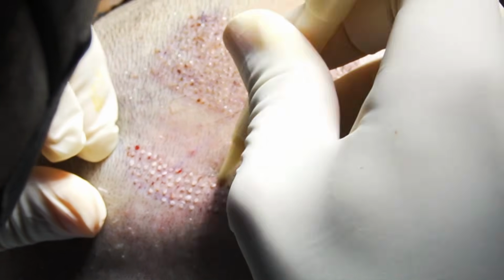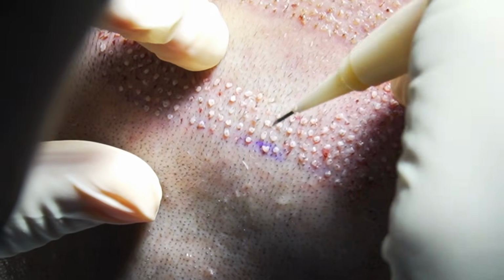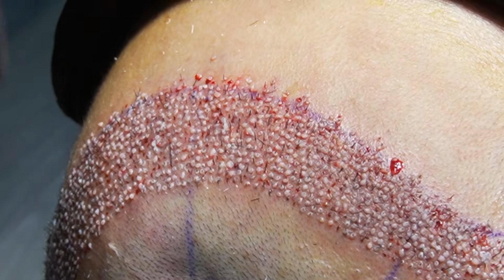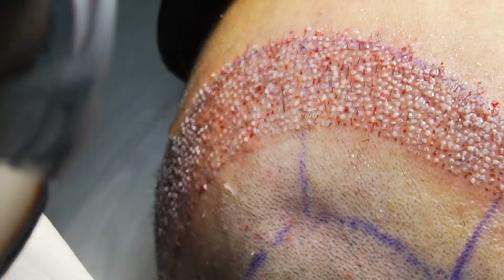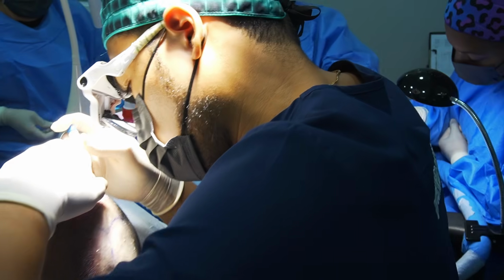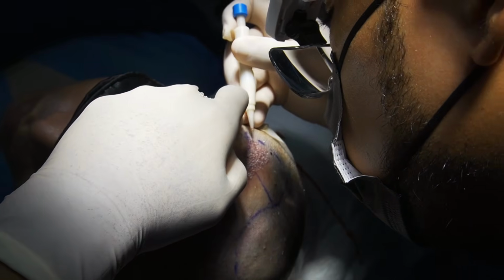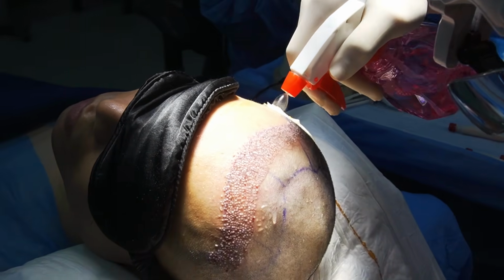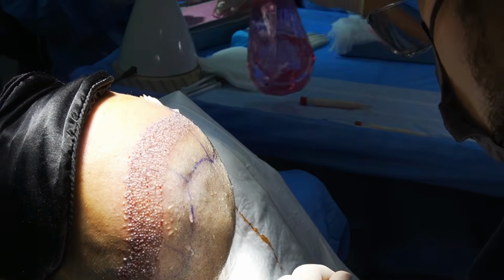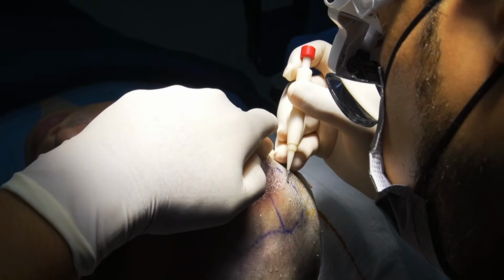Step 7. Direct implantation. After local anesthesia is administered to the recipient area, the implantation process begins. Using the DHI Implanter, each follicle is placed individually according to the previously established design. The physician controls the depth, direction, and angle of each implantation. These three elements are essential to ensure that the new hair follows the same growth pattern as the patient's natural hair. An important feature of DHI is that it is not necessary to create all the recipient channels in advance before placing the follicles. With the implanter, the creation of the recipient site and the placement of the follicle occur as part of the same implantation process. This allows the physician to work with a high level of precision, even around existing hair.